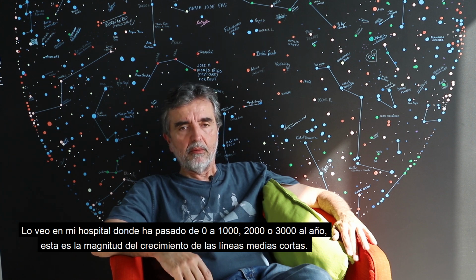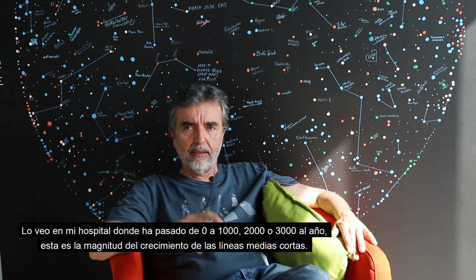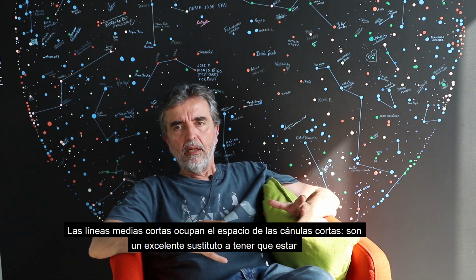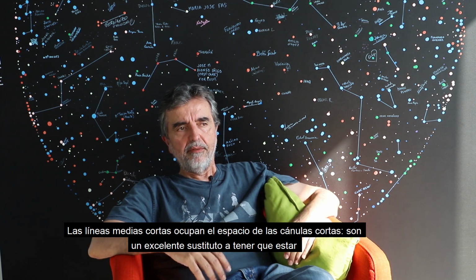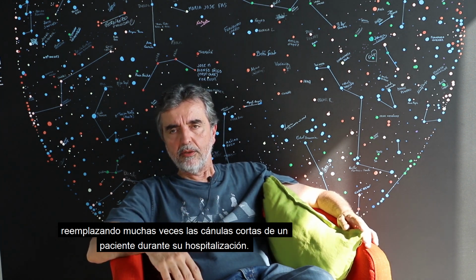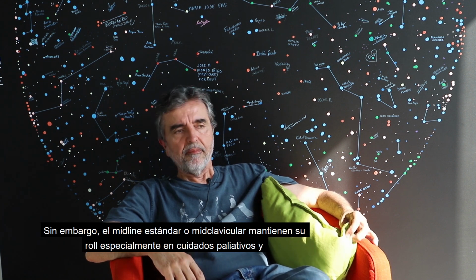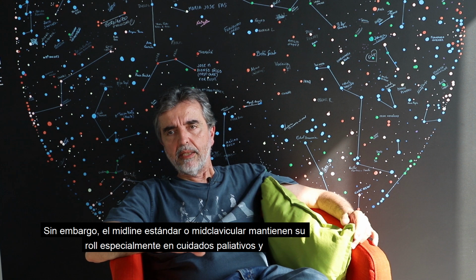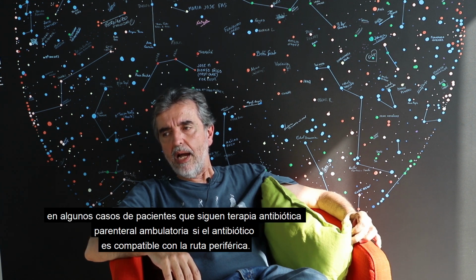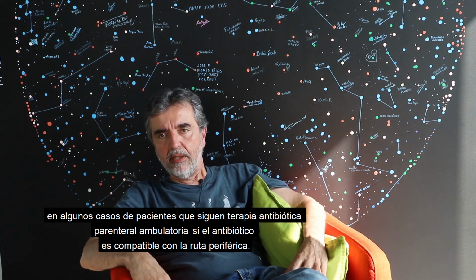And I see, for instance, in my hospital, a rise from 0 to 1,000, 2,000, 3,000 per year. This is the magnitude of the rise for the short midlines. Short midlines, they erode, so to speak, the field of the short cannulas. They are a terrific replacement of having the patient restarting many short cannulas during hospitalization. So they have their role basically in the emergency room and in the hospitalized patient. On the contrary, the standard old conventional midline, mid-clavicular, will keep their role in palliative care basically, and in some kinds of OPAT, outpatient antimicrobial therapy, if the antibiotic is compatible with the peripheral route.